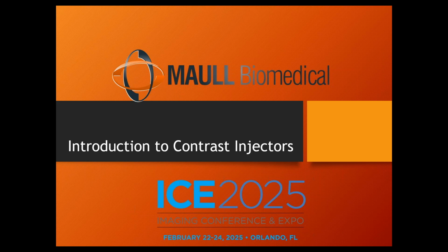So how this works, X-rays come out of the X-ray tube, and for our sake, this isn't 100% true, but for our sake, 100% of the radiation comes out of the X-ray tube and goes into the patient. Some of the radiation that goes into the patient is going to penetrate through the patient and strike that image capturing device underneath the table. And some of the radiation is going to be absorbed by the patient and just dissipate and never come out. So we have penetration and we have absorption. To get an X-ray image, you need both things to happen. Some of the radiation has to get blocked by the patient. Some of the radiation has to go all the way through the patient and hit that imaging plate.